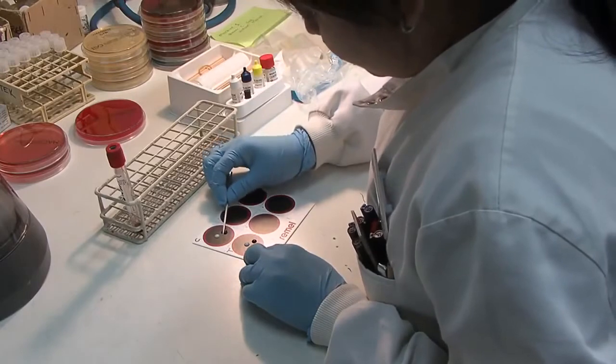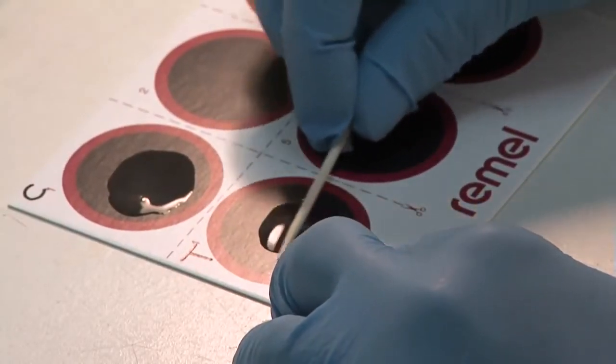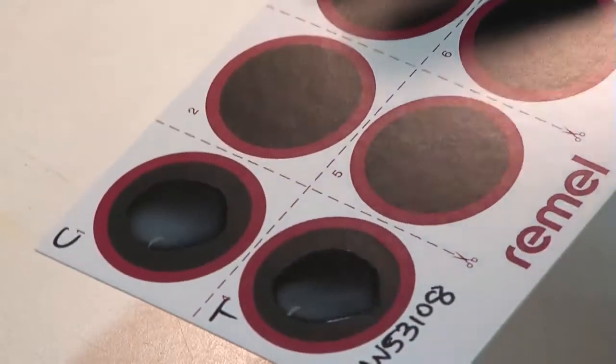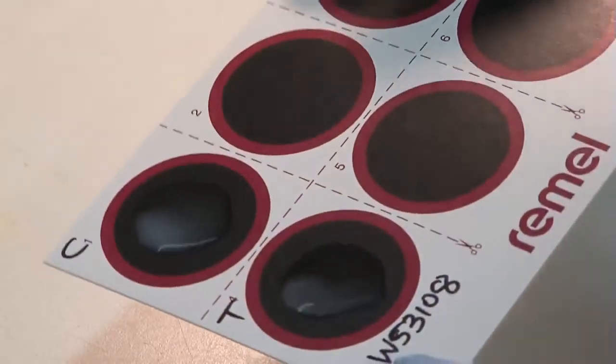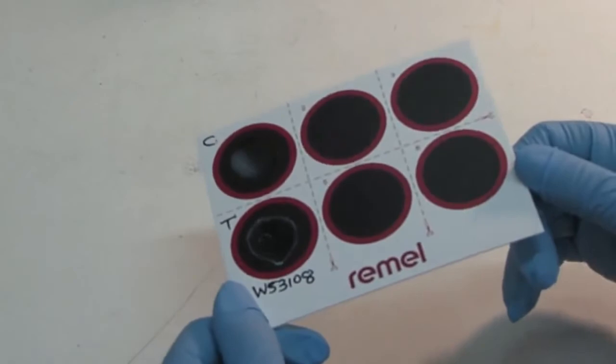Control and test latex particles are mixed with a drop of the blood. In this case, the test latex agglutinates with the blood and the control latex remains clear, thus indicating the presence of the pneumococcus, Streptococcus pneumoniae.